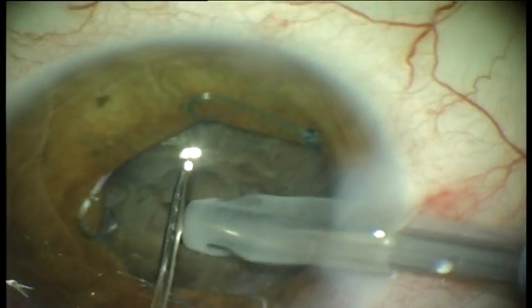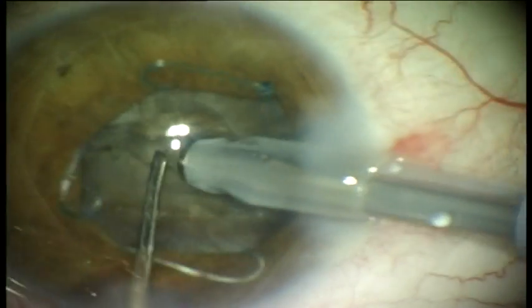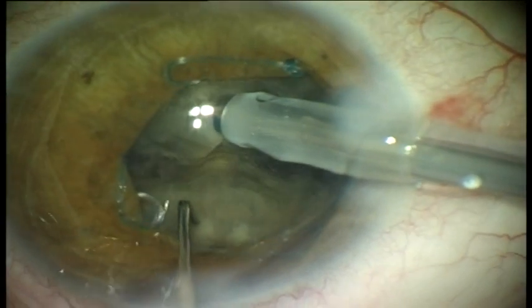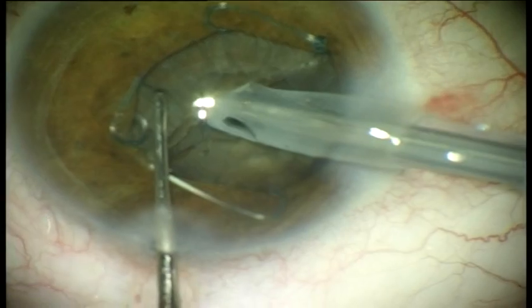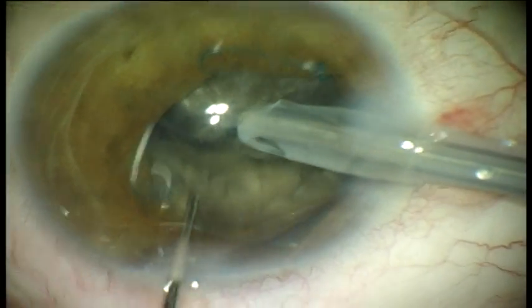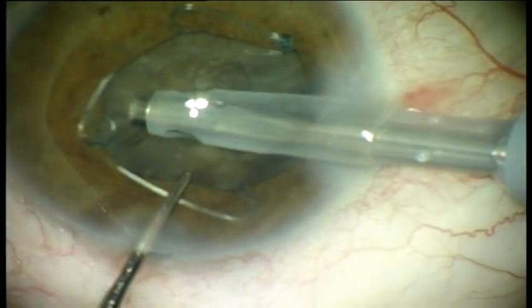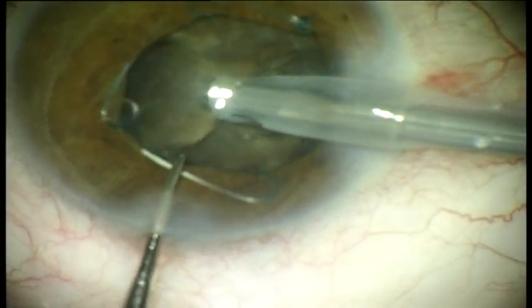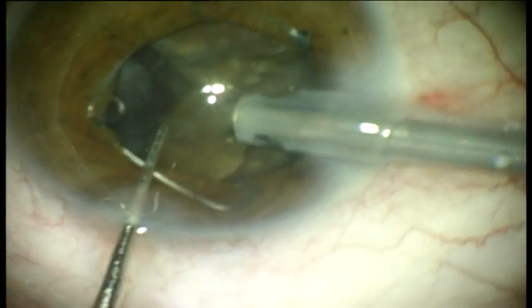Gentle fixation due to the unique design of the ring makes it particularly useful in cases with dense cataracts. The surgeon can work easily in the deep lens layers creating a trench or a bowl. During the cracking phase of the phacoemulsification procedure, when vacuum is at high settings, the ring is very stable. Multiple rotations and chopping in hard cataracts are possible without disturbing the ring or the iris.